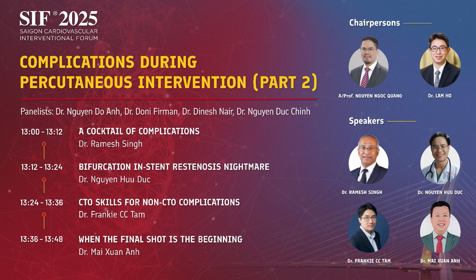Yeah, just for discussion's sake, I don't have experience either. Do you think if we use HDR in this scenario it would help? You just put the microcatheter at the ostium and then inject forcefully. Will this open a track for you? But you still have to go into the CTO body. The problem is this CTO, if you just do antegrade, there's a proximal cap ambiguity. We don't know where the cap actually is up there at the proximal CTO. So retrograde is still the quickest way to secure it.